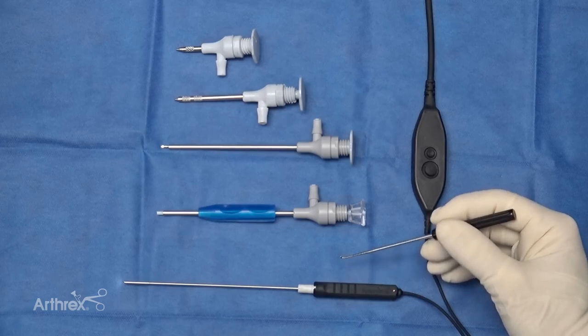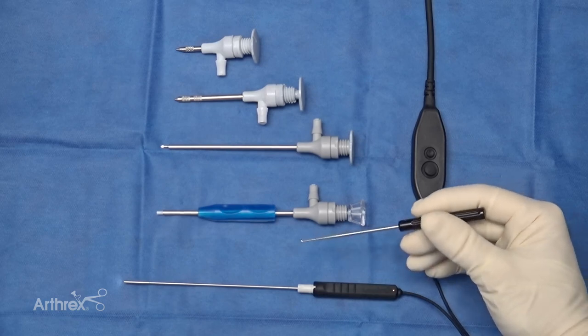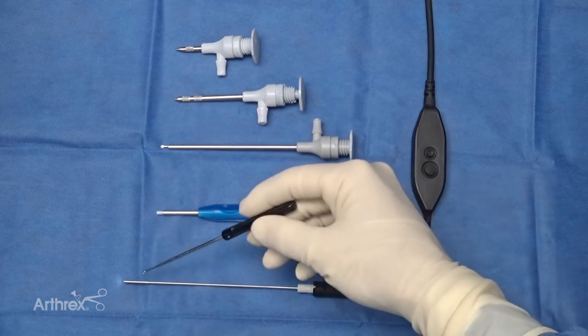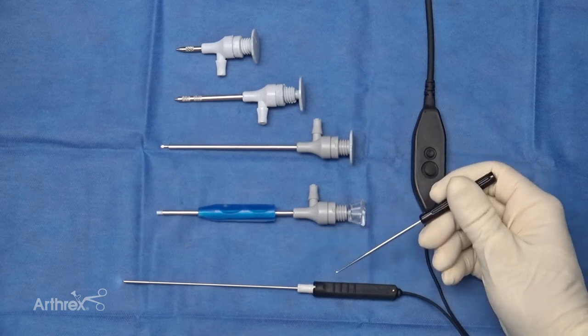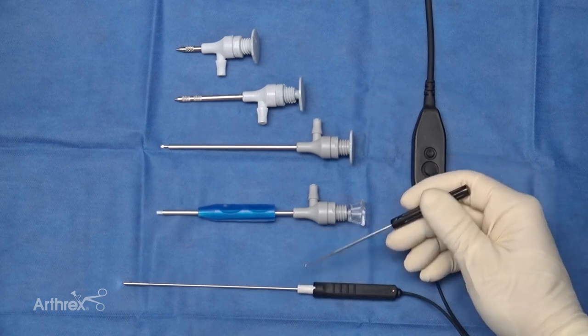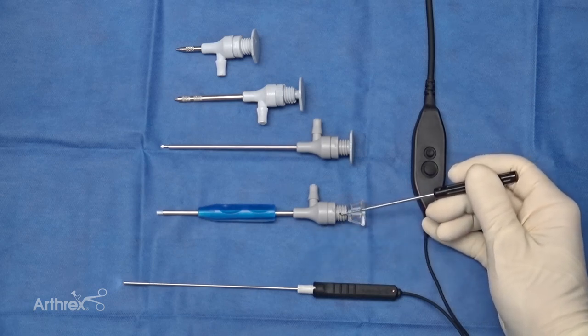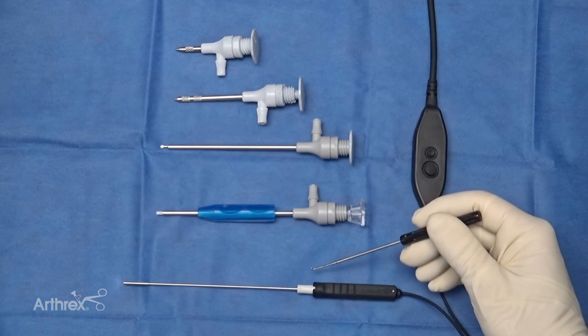Today we're talking about the new nano needle. The advantages compared to our previous nano is that it's very small — this is a 1.9 millimeter camera. We're also excited that the junction between the nanoscope and the trocar will now snap and click into place, which will prevent some of the pistoning that was a problem on the previous generation.